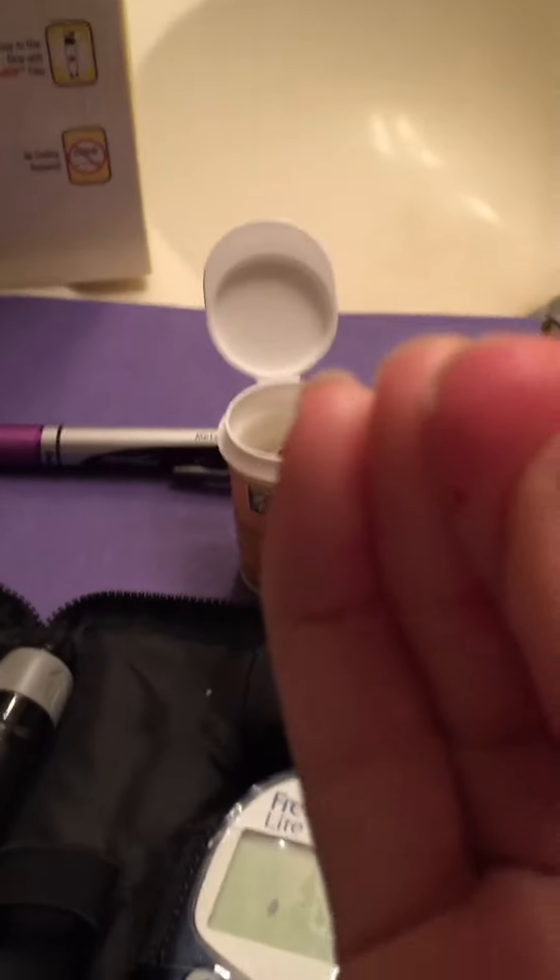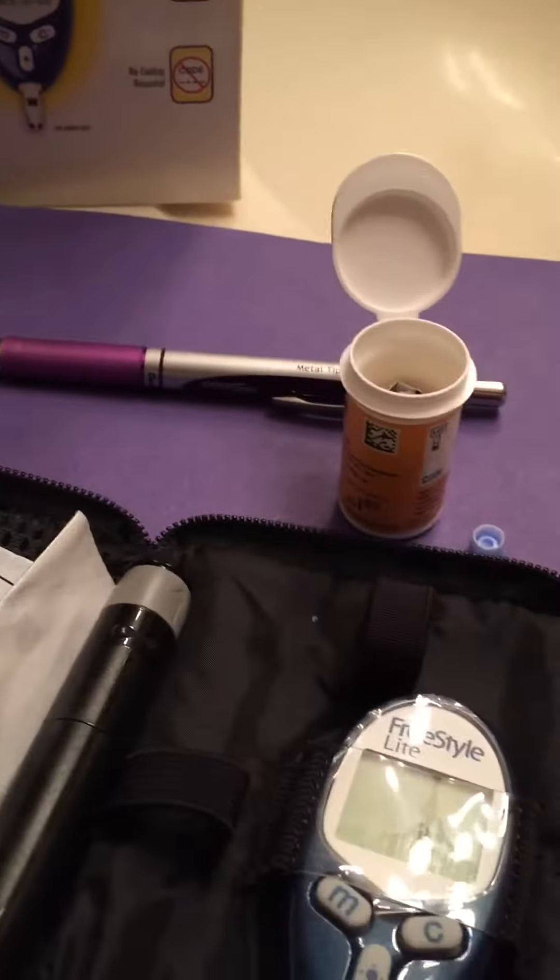Then I go for a blood drop, getting a blood drop, and then I put it into the device and it pops out a number.